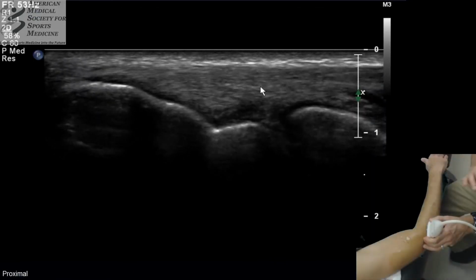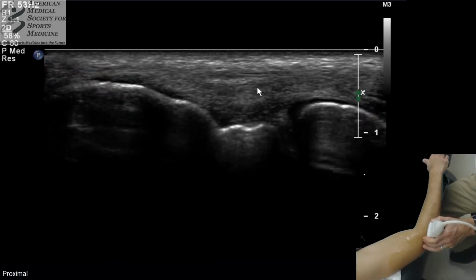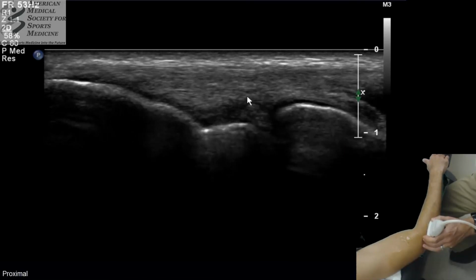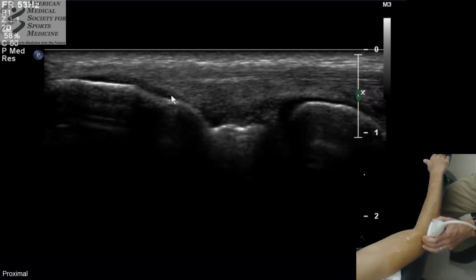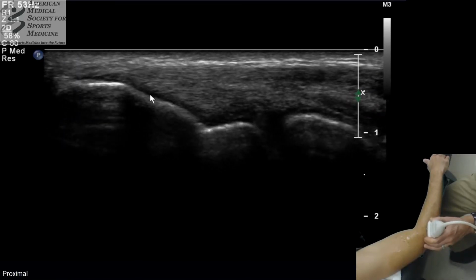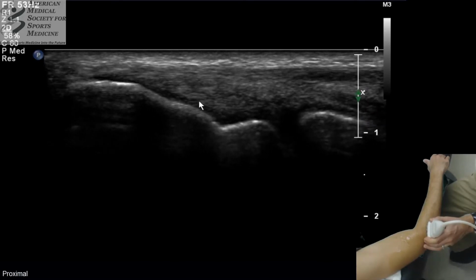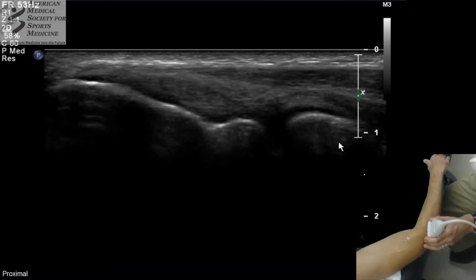One thing that you can do while you're looking at the lateral elbow is stress the radial collateral ligament and look for integrity of the lateral collateral ligament and see if there's any laxity in the joint, the radiocapitellar joint. So here again, I'm getting that ski jump view of the elbow. So we remember that the deep 30 to 50% of this is going to be your radial collateral ligament. So here's the radiocapitellar joint.